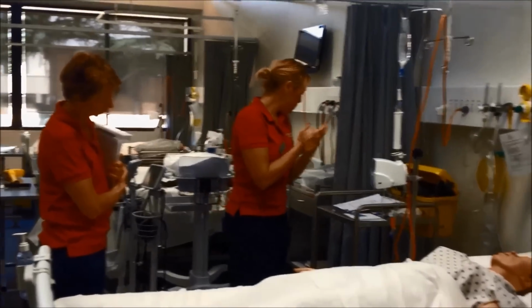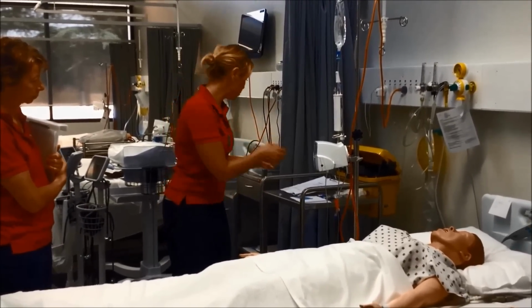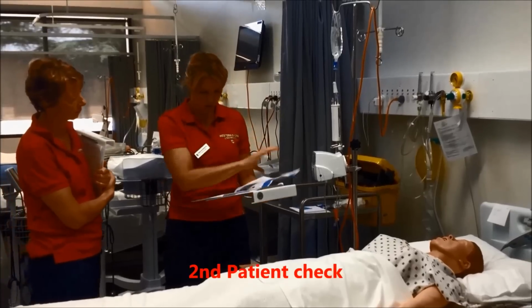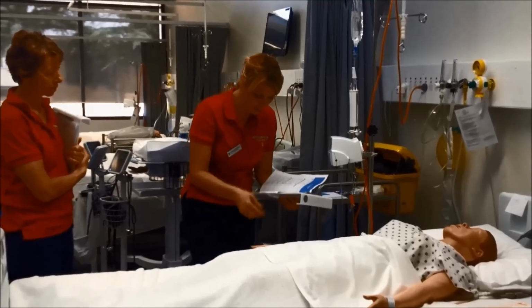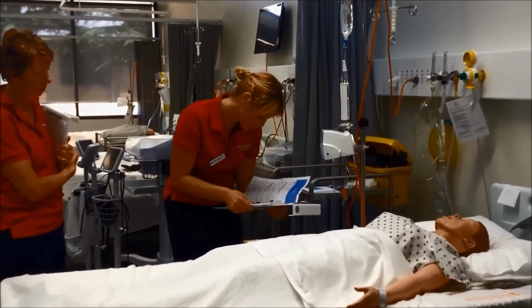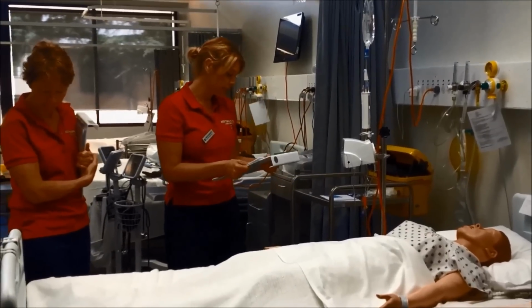Okay, Mr. Lockyer, I'm back. I'm about to start your antibiotic. Tell me, what was your name? James Lockyer. James Lockyer, and your date of birth? First the 3:45. First the 3:45, yes, and I'll just check your MRN. 8, 9, okay, they're all correct. Do you have any allergies, James? No. No.